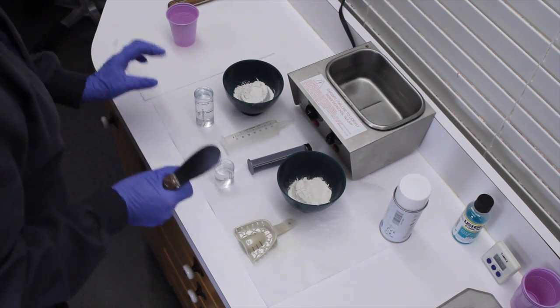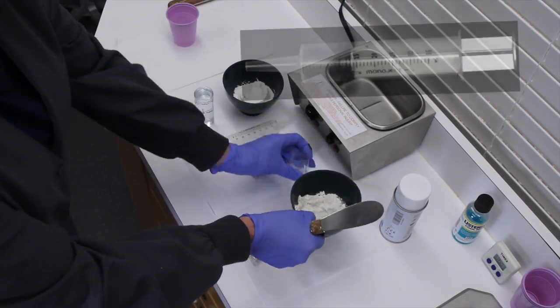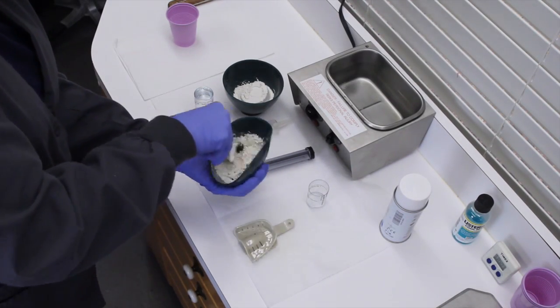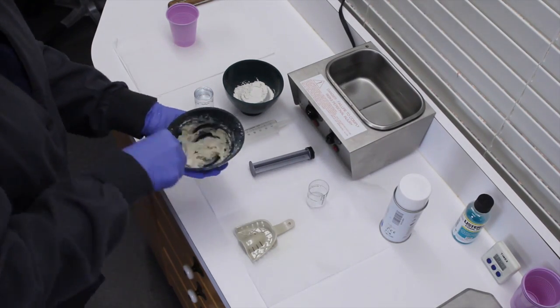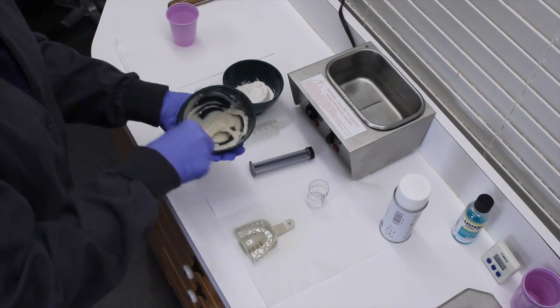And while she's mixing, I'm going to make a comment here. Something else we did not talk about, which you'll see there, is a 35 milliliter syringe. And those are very readily available. I get mine actually on Amazon. They're very inexpensive. But that syringe is what we're going to actually use to syringe the material into the patient's mouth, which we'll demonstrate in our next segment.